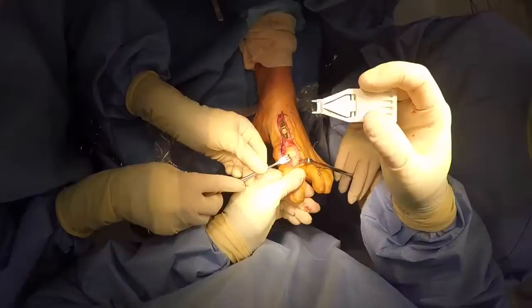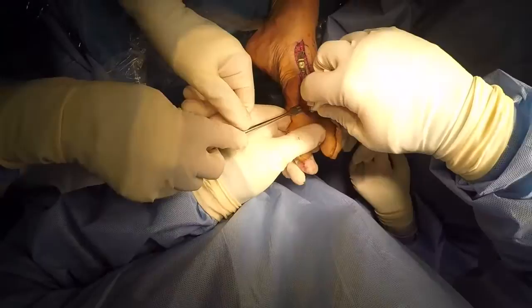This is an 8mm staple, which is placed directly into the created holes, and the tab is popped, thereby releasing the staple.